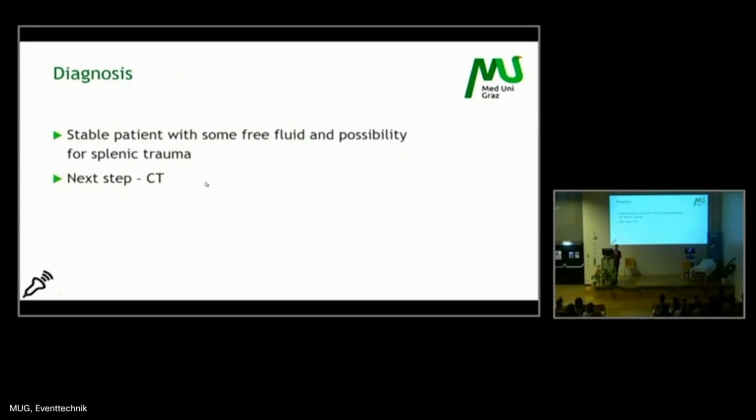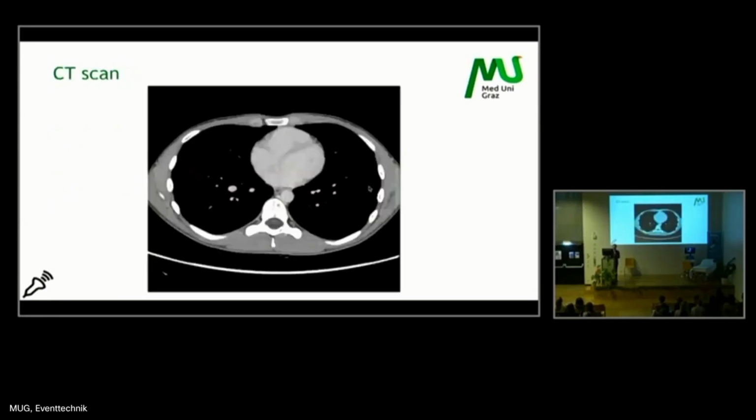The patient was stable, and we weren't sure if there was splenic trauma or not. So in a stable patient with a positive eFAST, the next step wouldn't be surgery, but CT. And I'm going to show you the CT scan.